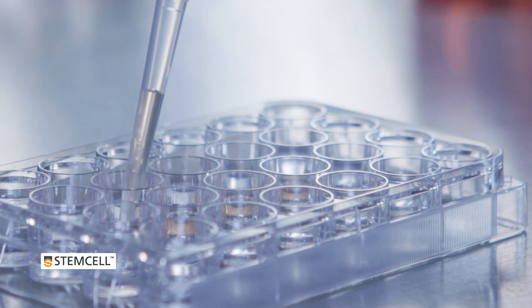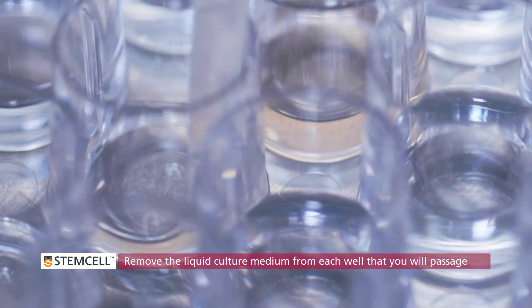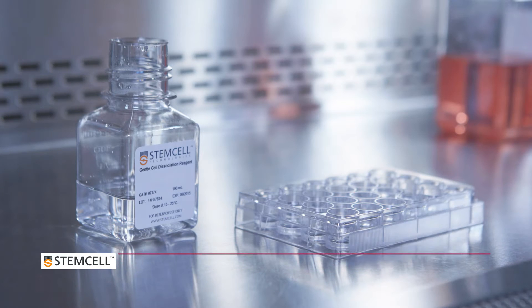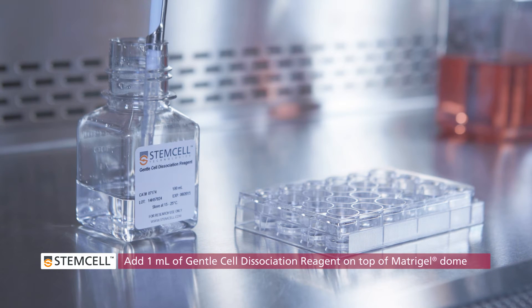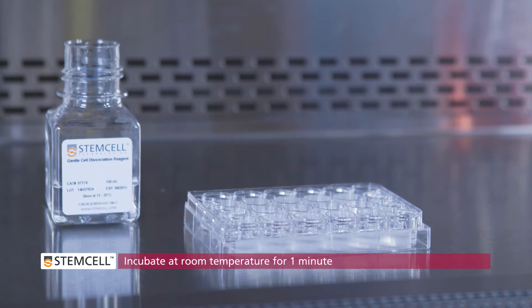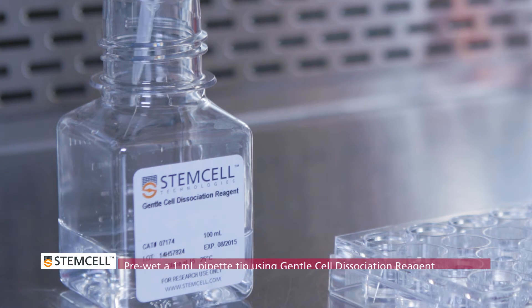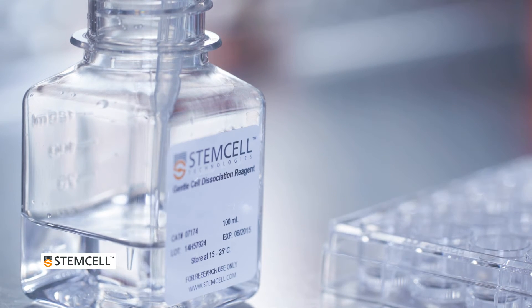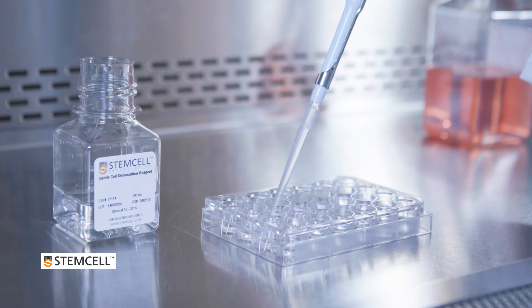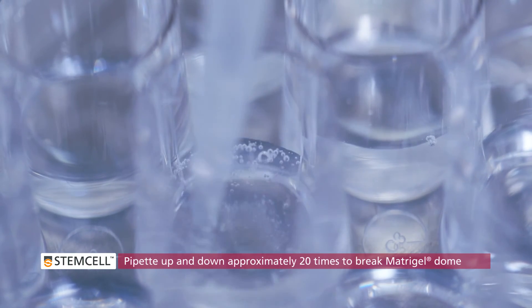Using a micro pipette and 1 milliliter pipette tip, completely remove the liquid culture medium from each well that you will passage. Position the pipette tip at the bottom edge of the well so as to avoid disturbing the matrigel dome. Add 1 milliliter of gentle cell dissociation reagent on top of the exposed matrigel dome. Incubate at room temperature for 1 minute. Pre-wet a 1 milliliter pipette tip using the gentle cell dissociation reagent. Throughout the procedure you will need to pre-wet pipette tips and serological pipettes before manipulating organoids or crypt suspensions to prevent the tissues from sticking to the wall of the pipette. Break up the matrigel dome by pipetting the 1 milliliter of liquid up and down approximately 20 times.